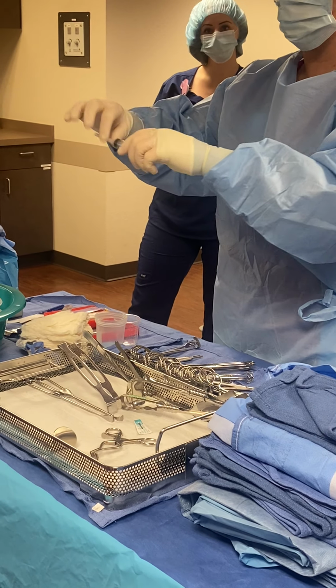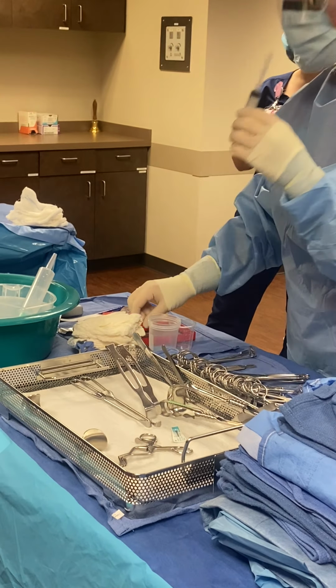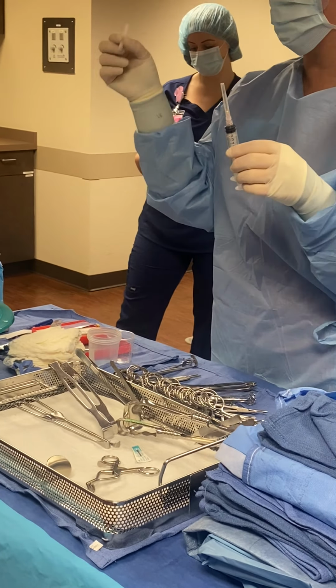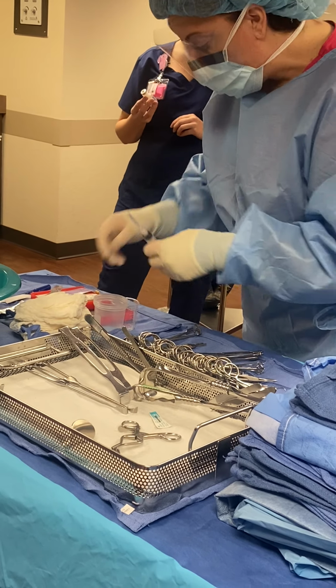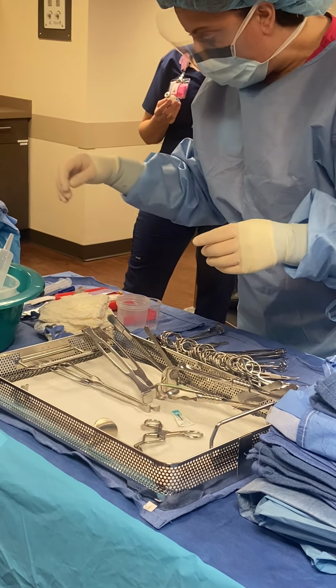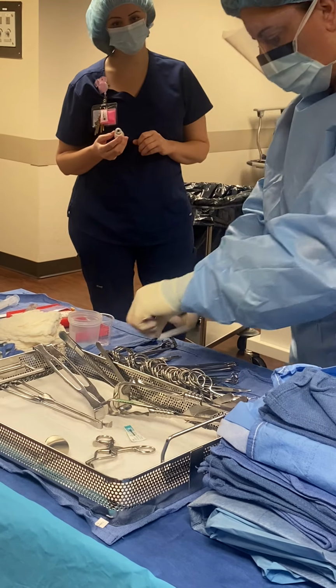If you put it on there too tight, you're not going to be able to get it off. So that's what you want to draw up with, not what you want to poke your patient with. We're going to use a smaller one to inject, so we'll switch them out. Okay, so we load that up and then we'll make our label. Let me make sure I get the right side.